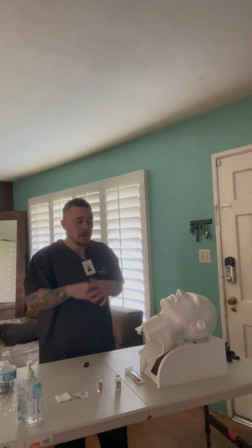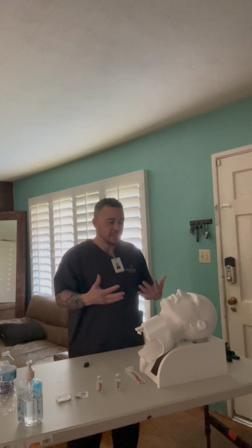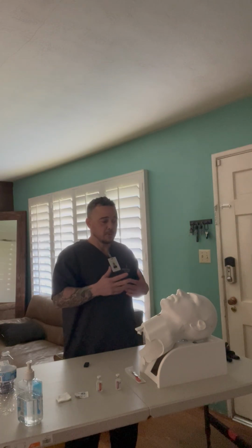Once I walk into the room, I'm going to make sure I use proper hand hygiene. I'm going to introduce myself to the patient. Hello, Mr. Ramirez. My name is Tristan. I'm here to administer insulin, your medication. Can you please tell me your first, last name, and date of birth? Okay, thank you. I got the 2 patient identifiers. And then I'm going to ask if he has any allergies to food, medications, any substances.